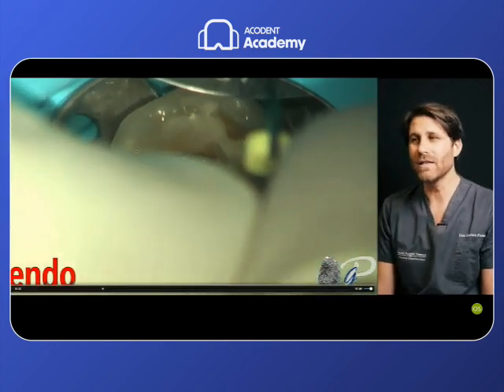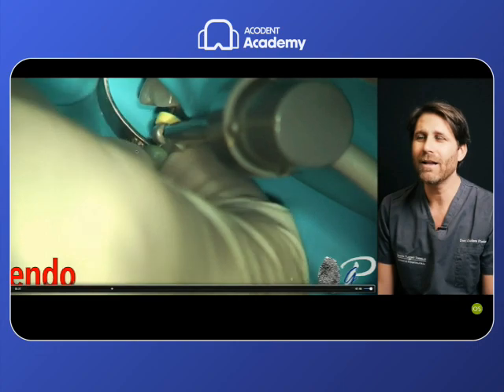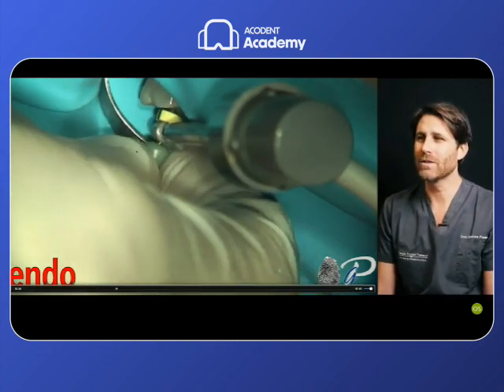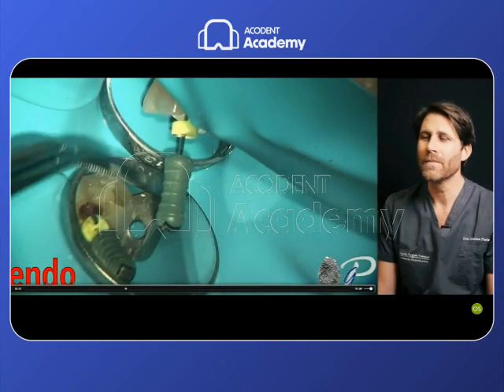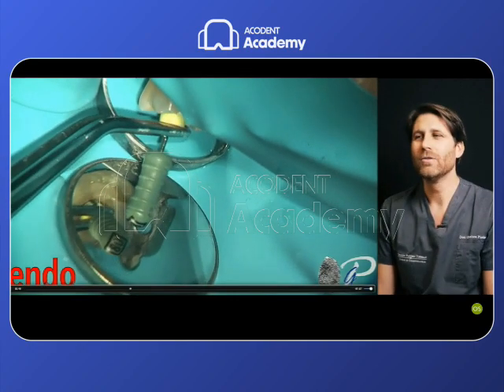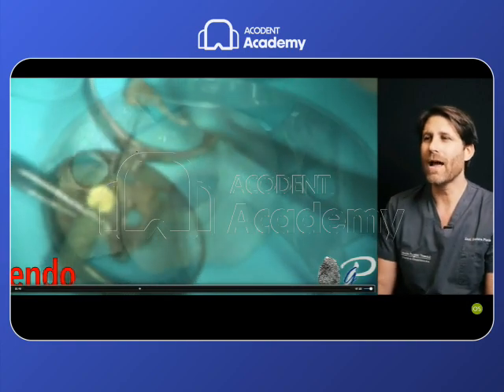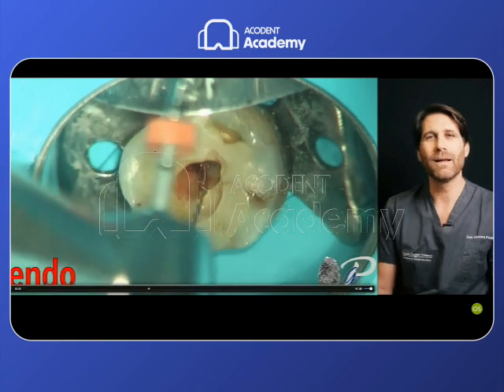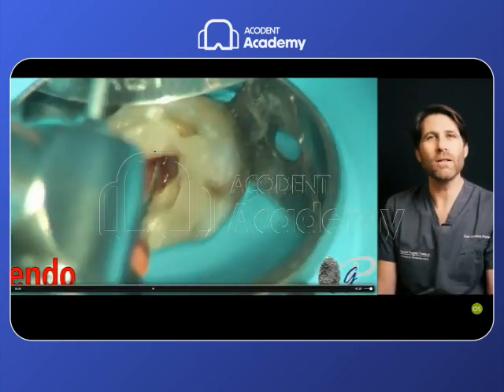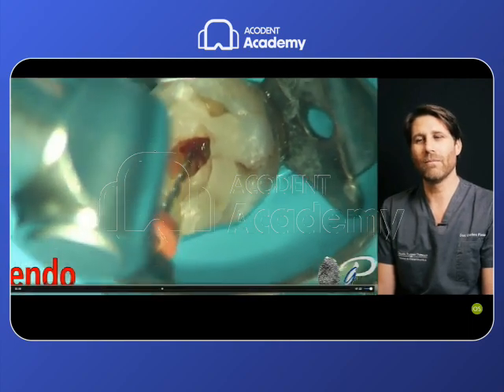So after the 6, I use the size 8 stainless steel K file under the control of the apex locator with this small watch winding movement, without working on the file, to try to reach the working length. Just exploring the apical path. And look, there was an abrupt apical curvature, but the natural path was explored because the trajectory was compatible with this stainless steel file.